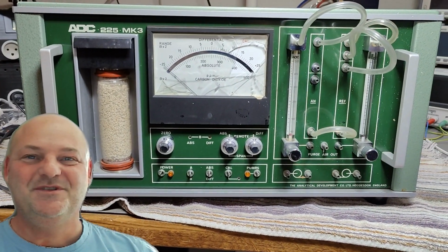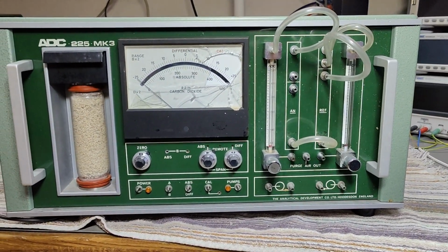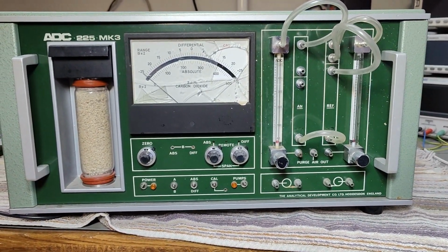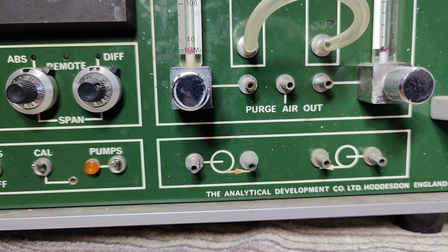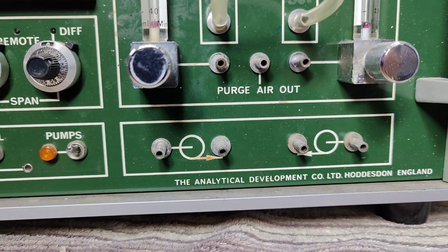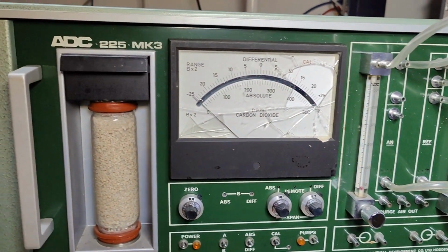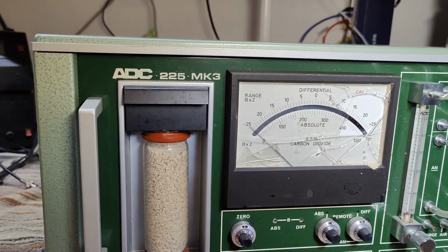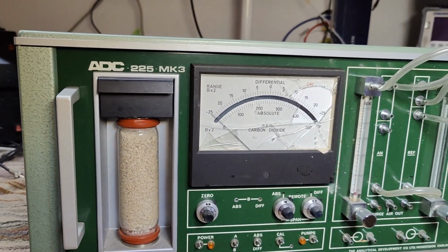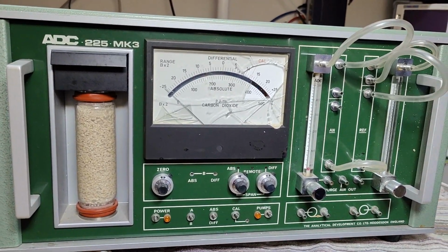Welcome to a new test and teardown video. This time it's something from a medical lab. It's called the Analytical Development Company. Oh, that is nice. And the product is an ADC 225 Mark III. So it's quite obvious what this thing does, isn't it?